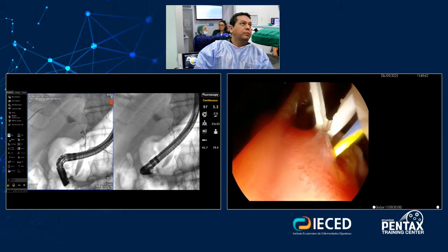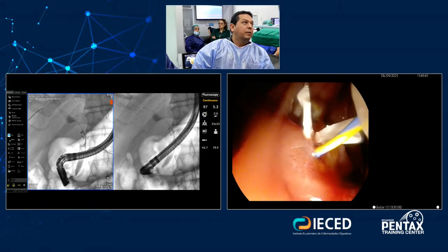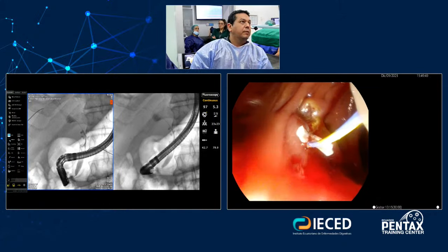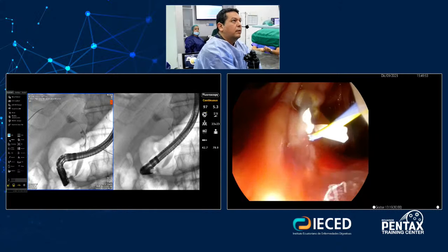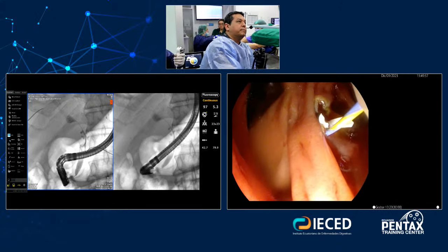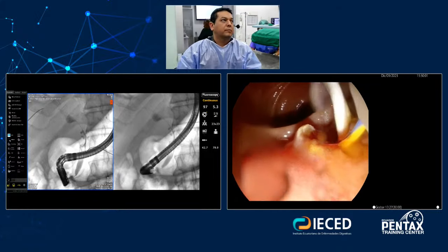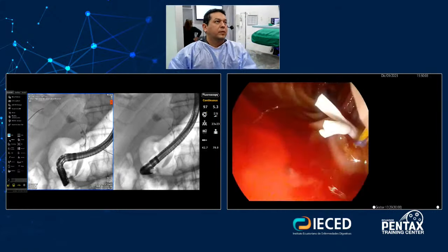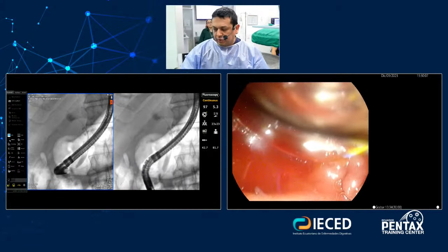I'm just trying to, okay, perfect. Wait a moment. Okay, let's go. So I pass a 9 French cholangioscope.